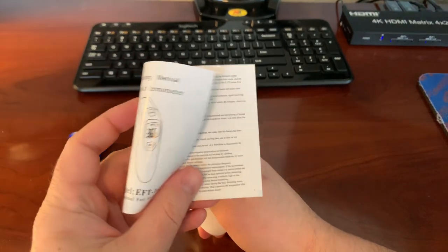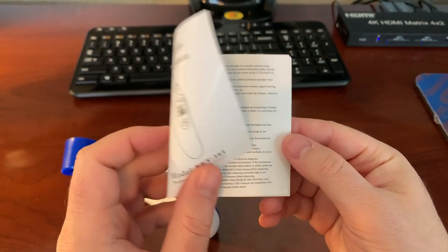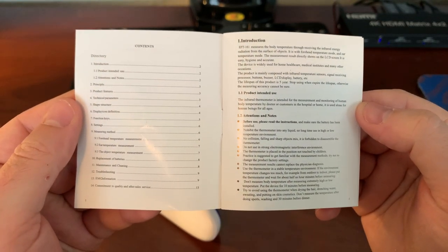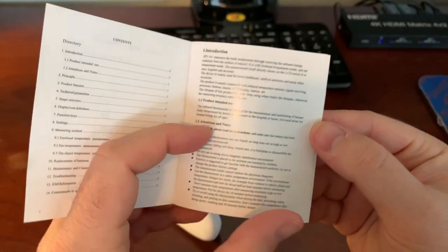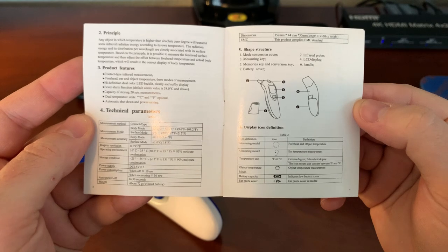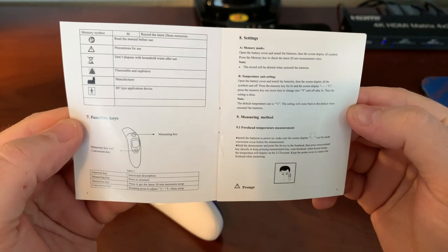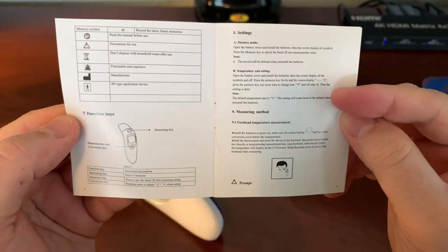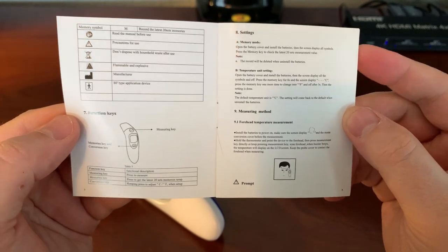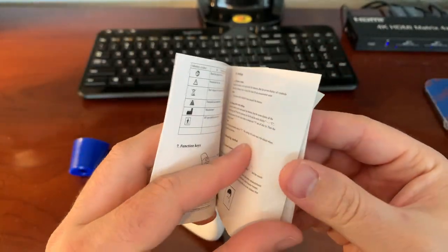I just want to give you the opportunity to look at this manual in case you've lost yours. You can pause the video on any of these screens to take a look at it. Here's the verbiage to change the units — it wasn't very clearly written, so hopefully this video was helpful in that regard.